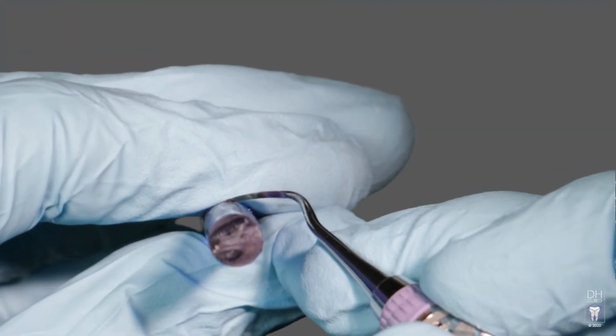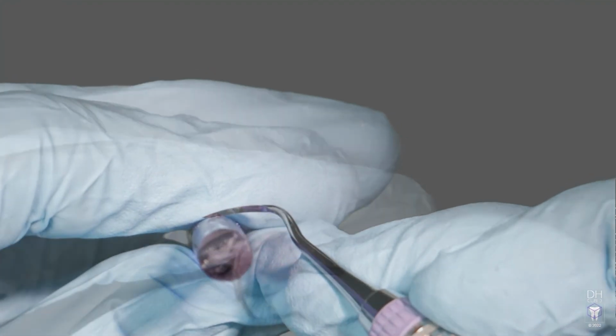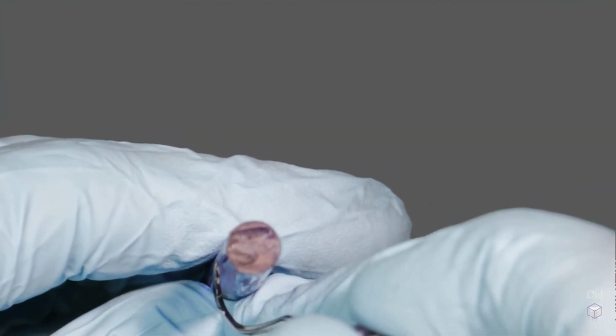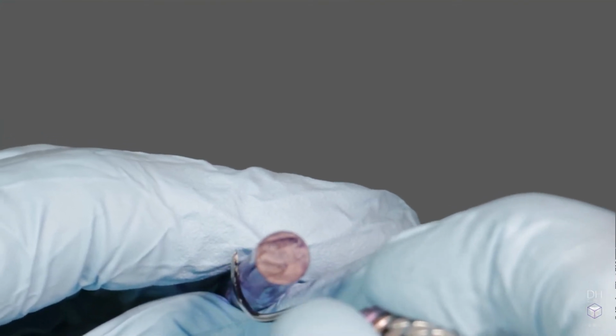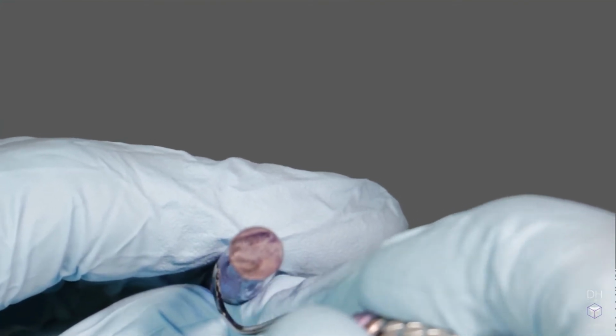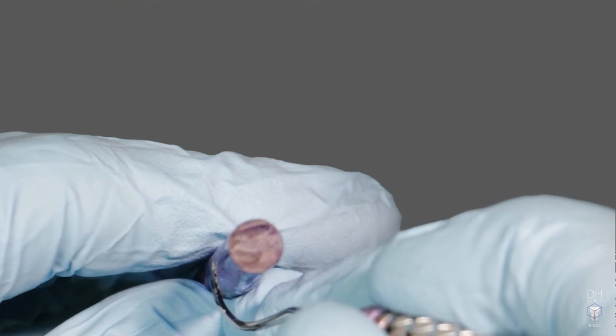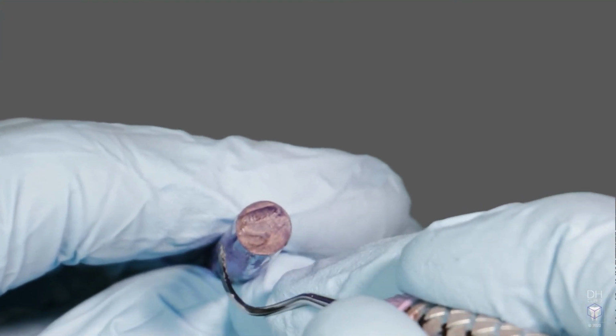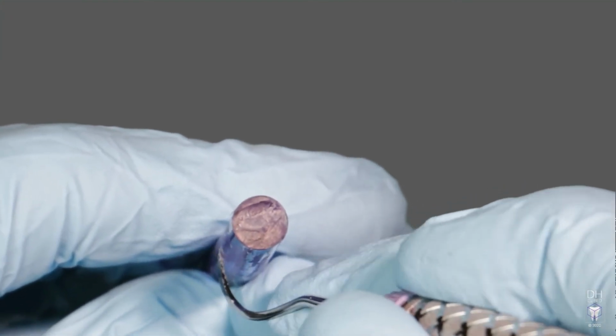Often, we are taught to test for sharpness by getting the instrument to bite the stick. But when you press hard enough, any instrument will bite the stick. The pressure required to bite the stick is the same pressure you will need to apply to the tooth. Therefore, the less pressure you have to apply to the stick, the less pressure you will need to apply to the tooth to get it to bite.